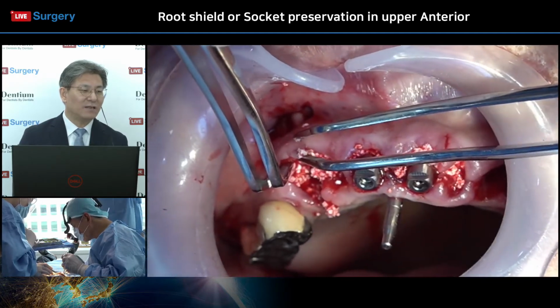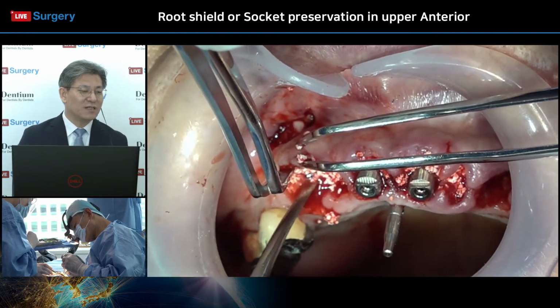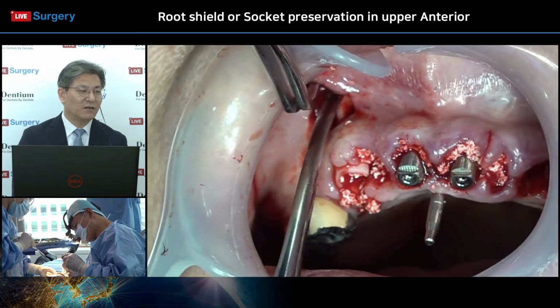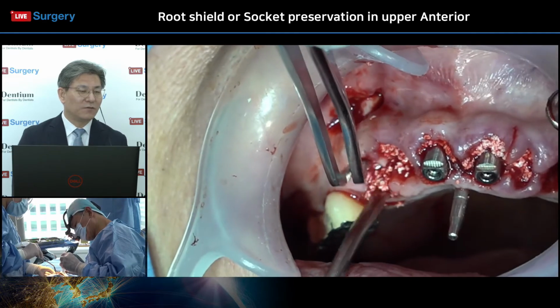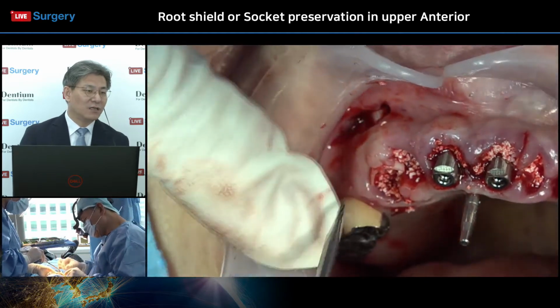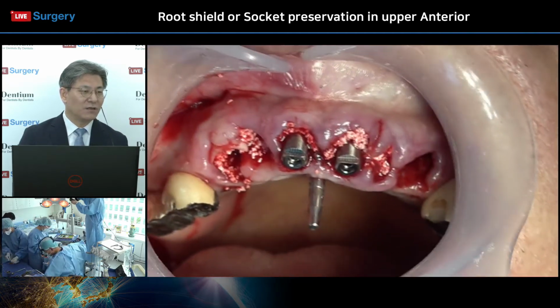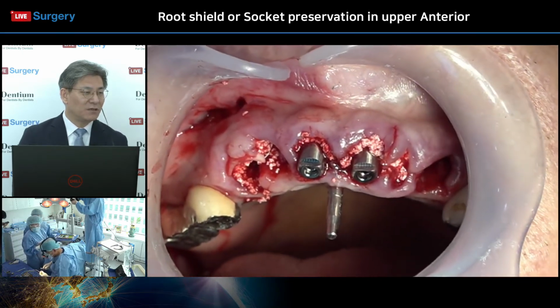So when you have an L technique, like Dr. Donald Chung suggested, combined with this kind of long-lasting membrane, you're getting a better result, right? So for me, when I use the L technique with the collagen graft materials, I always use this collagen membrane for a guaranteed result. So bone grafting was done.